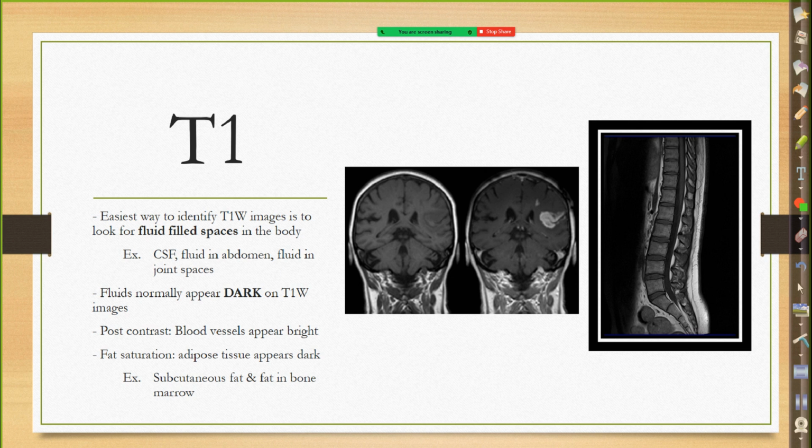Yeah. You'll see it in the weighting. So we'll see T1 weighted. It'll have T1 and a W, and then you'll have an FS behind it because it's now fat saturated. It's designed to saturate the fat so that you can see a lesion easier. So some sequences are fat satted, and the adipose tissue will be dark. None of these sequences right here are fat satted, so the adipose tissue is not dark yet. But that's another RF pulse we have to add specifically to saturate fat. But that's when we start to talk about pulse sequences. We'll get to that.